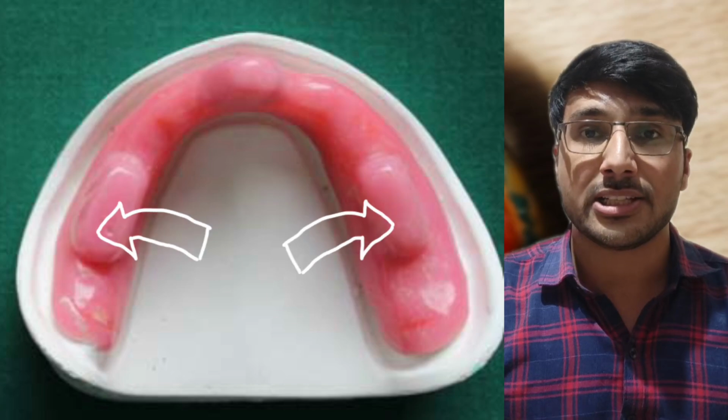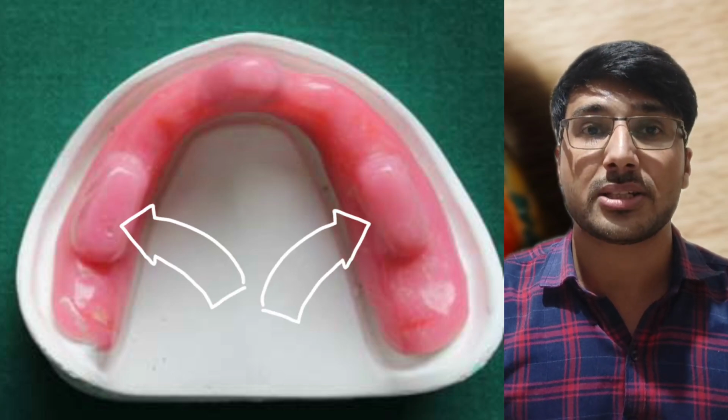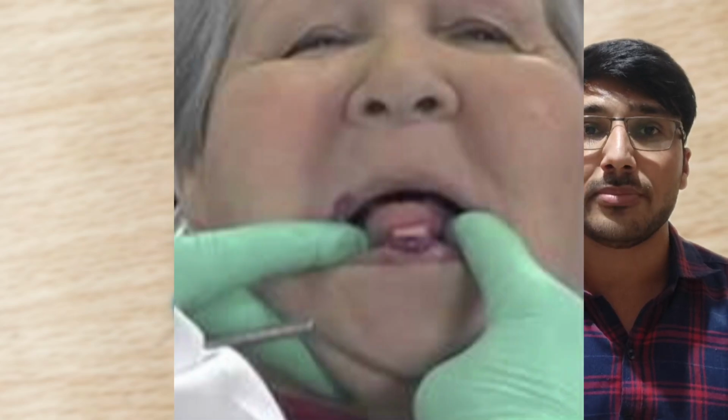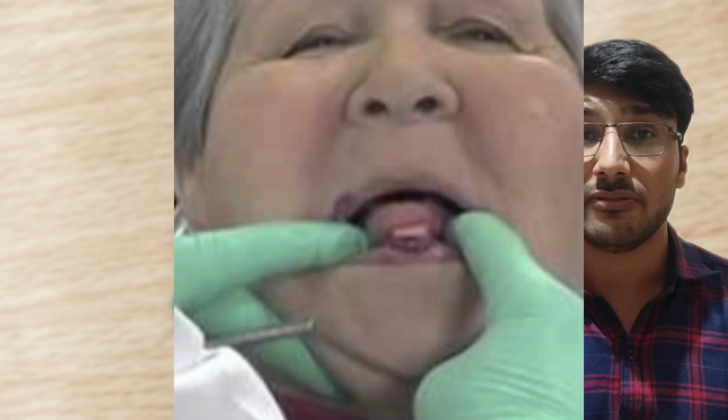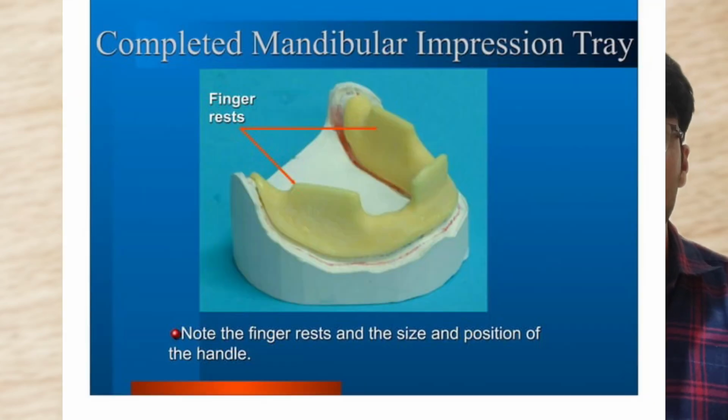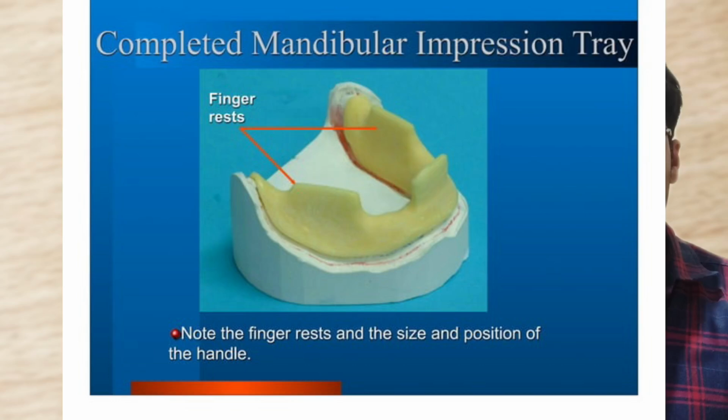In the mandibular impression, 2 additional handles on each side should be placed on the first molar region. Why? Because most of the time we displace the soft tissue in the posterior mandibular region with our fingers while placing the tray and border molding. The posterior handles are used as a finger rest to complete the tray placement and stabilize the tray in the correct position with minimal distortion in the soft tissues.